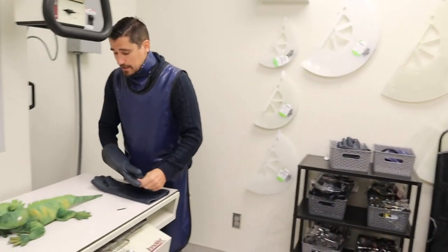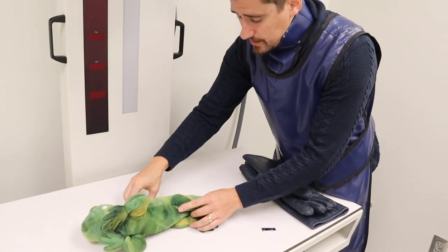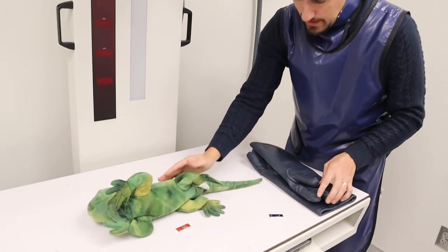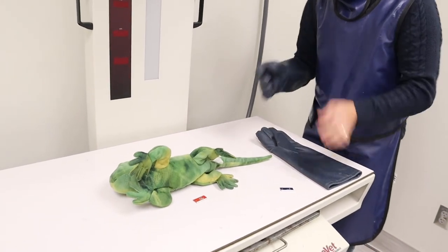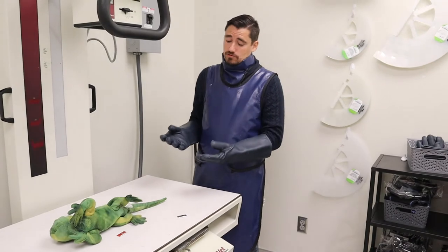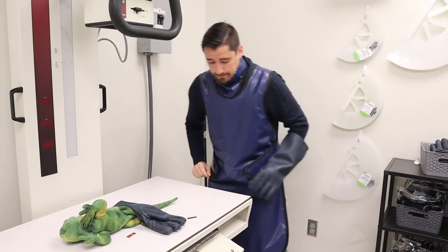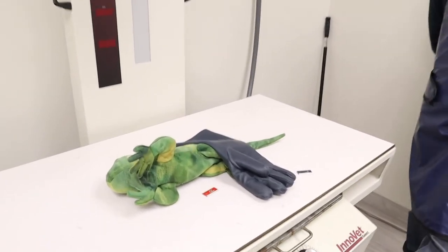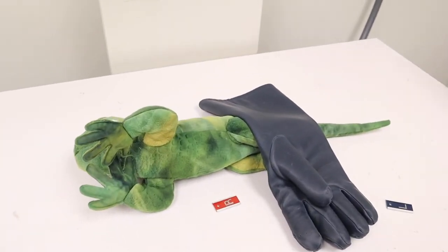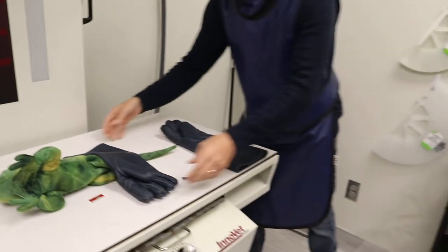Let's go ahead and put him on his right side — you're going to have someone helping you, of course. He goes on his side like this. If the patient is doing really good, I can step away a little bit and then shoot. Because remember, our goal is to get as far away from the exposure as possible.